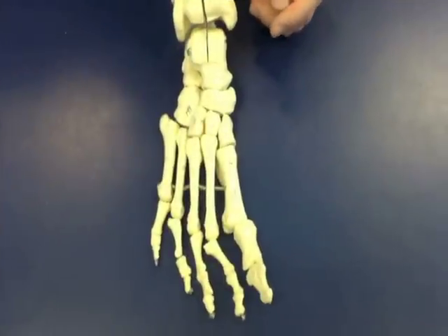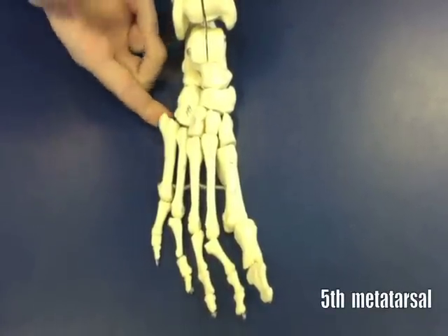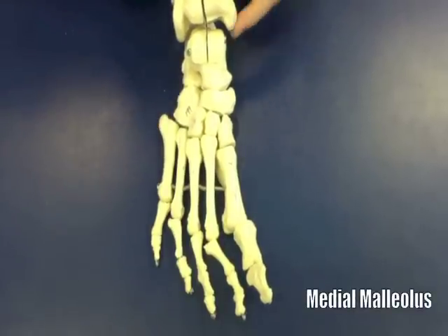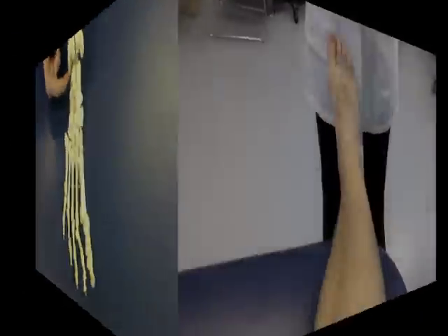The bony landmarks you want to find are as follows: navicular tuberosity, base of the fifth metatarsal, distal tip of medial malleolus, distal tip of lateral malleolus.